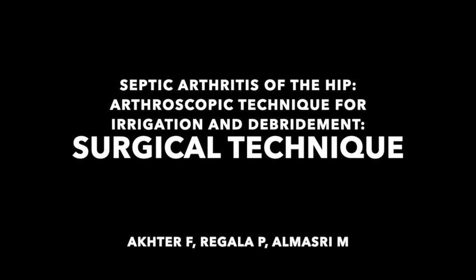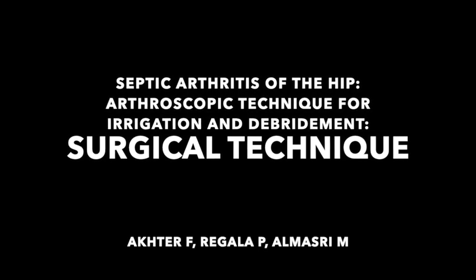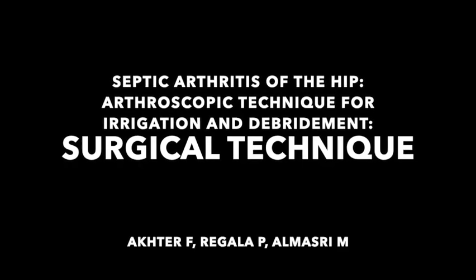The following video demonstrates a surgical technique using hip arthroscopy for an irrigation and debridement of a septic hip.